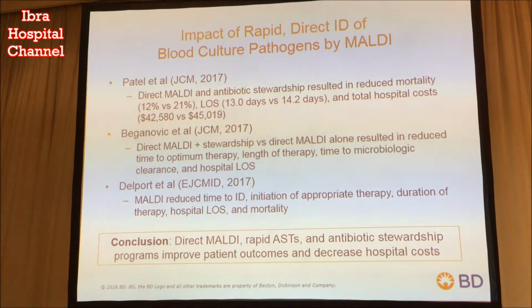using this system. A second study in 2017, again using MALDI and the stewardship program, when they compared that with just MALDI alone, they saw that there was an improvement in therapy, length of therapy, and time to microbial clearance and hospital length of stay. So although we see benefits alone with rapid identification with MALDI, when you combine that with an antimicrobial stewardship program, you see even more significant improvements.